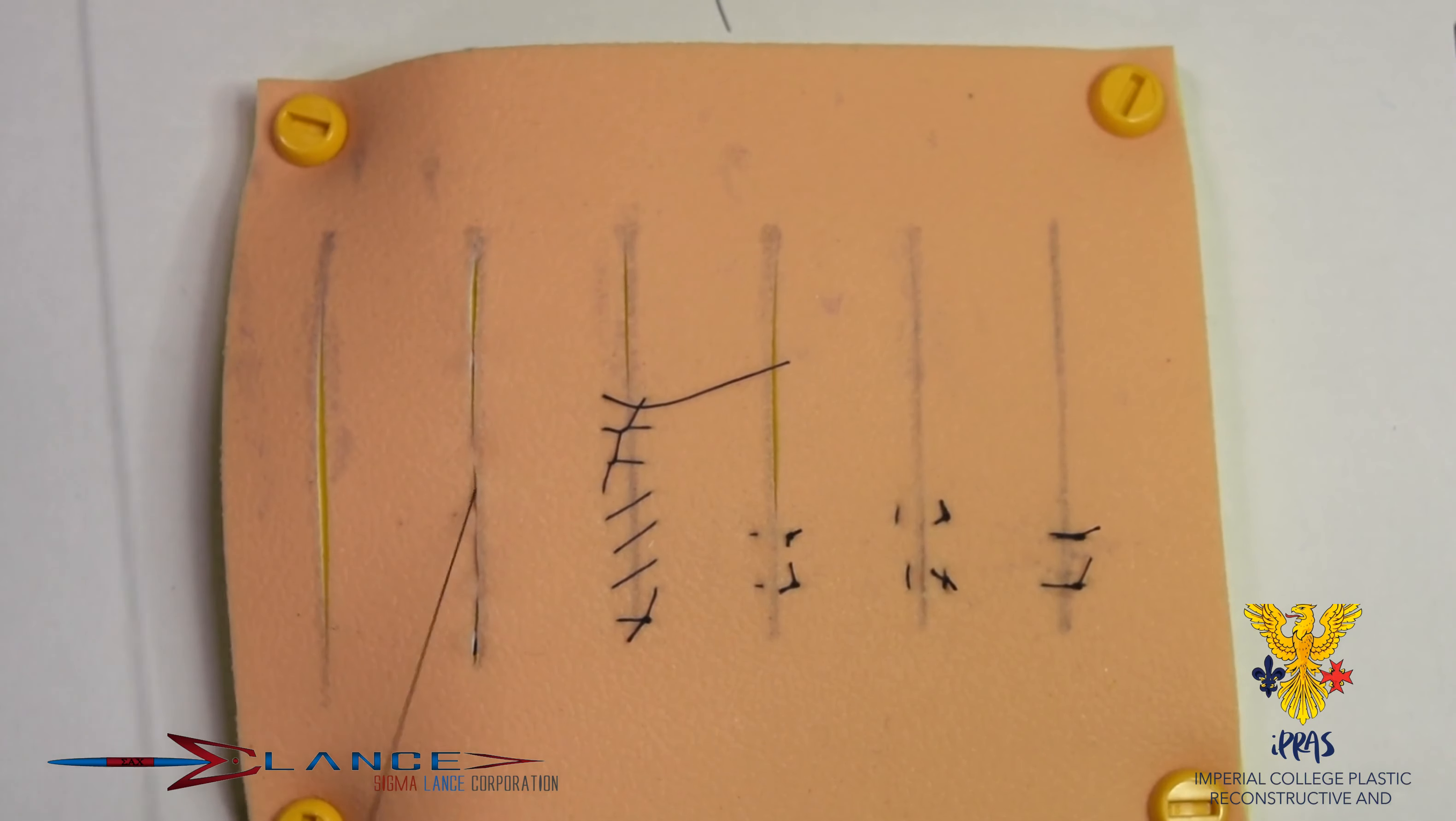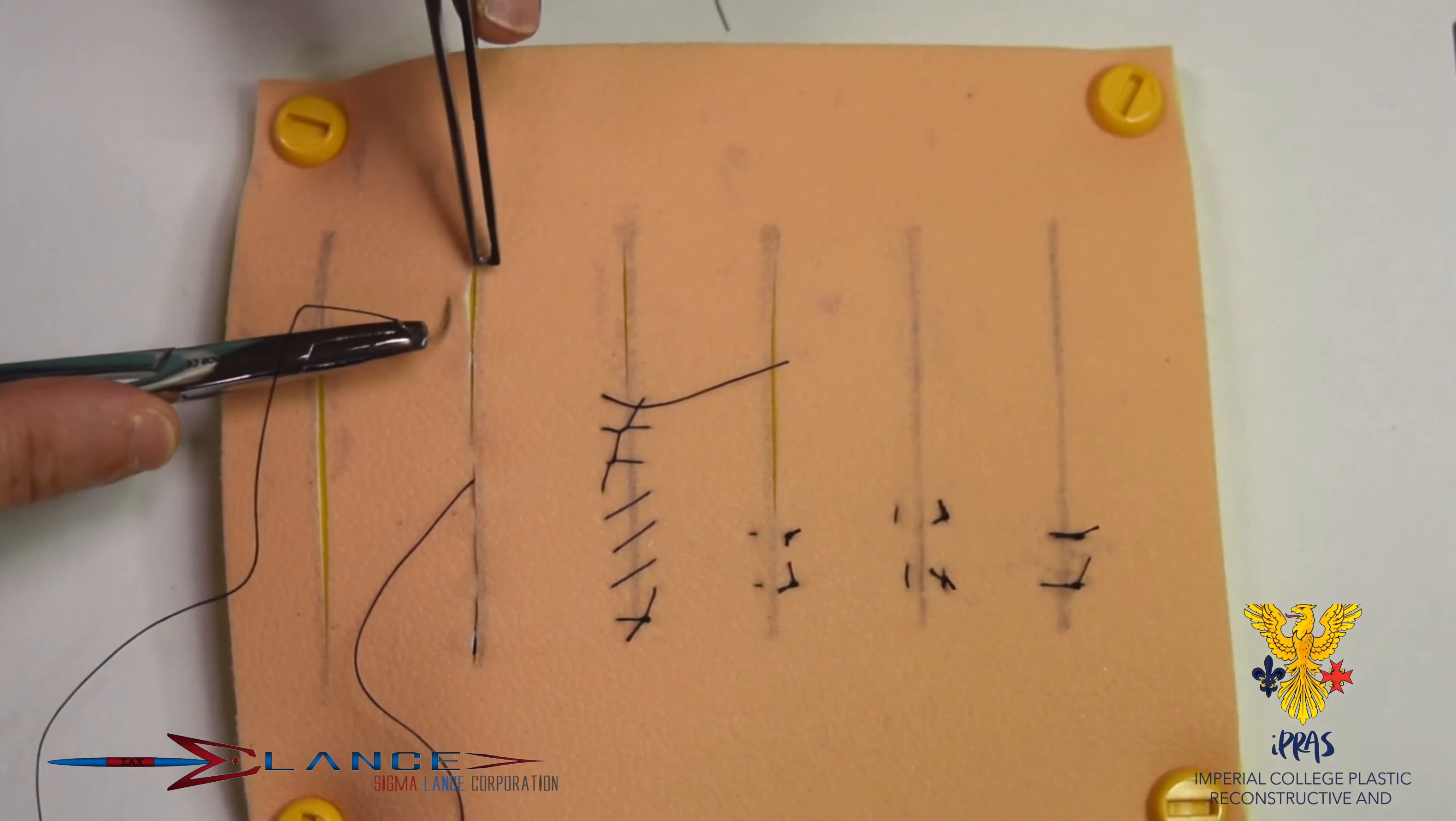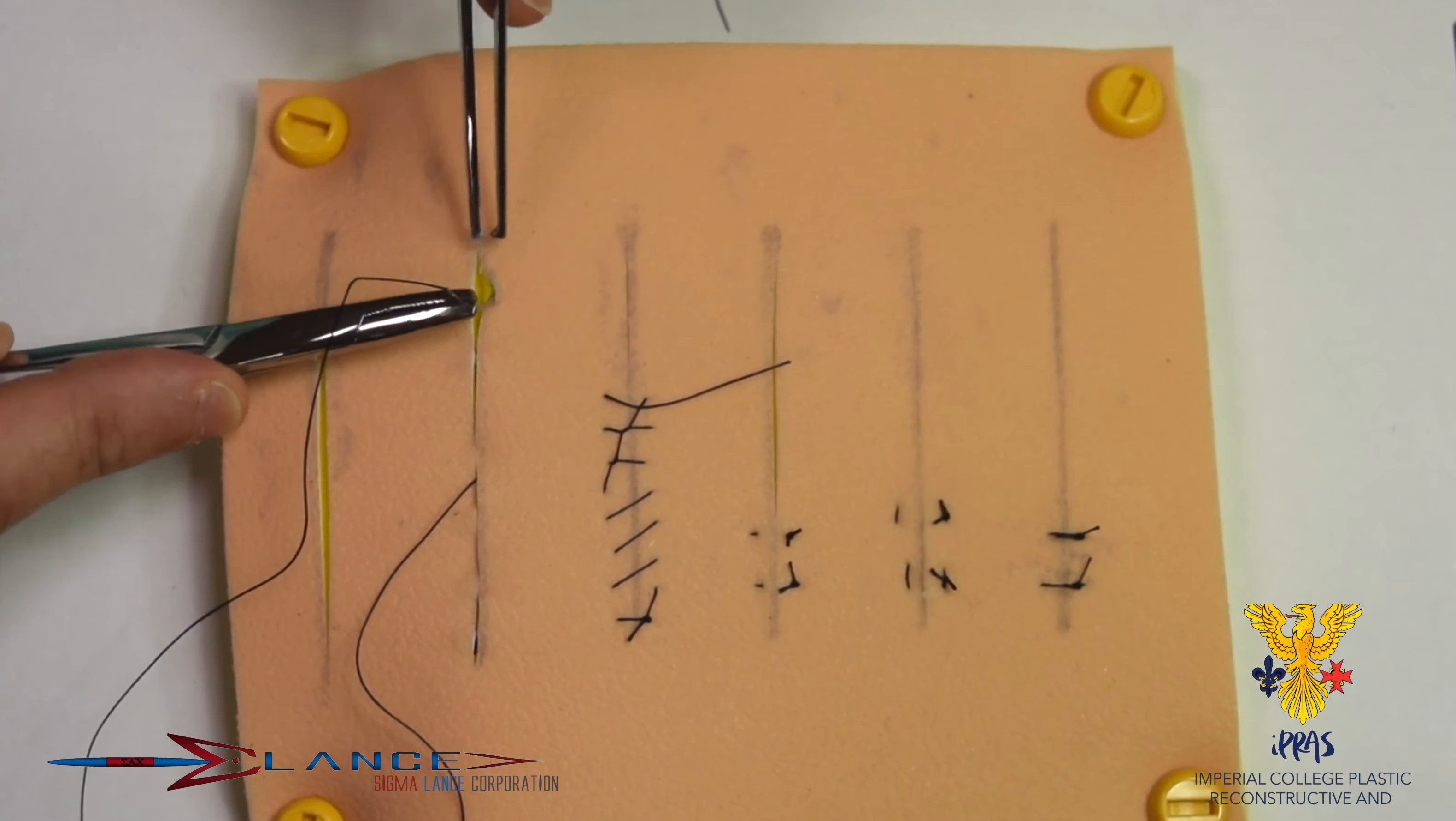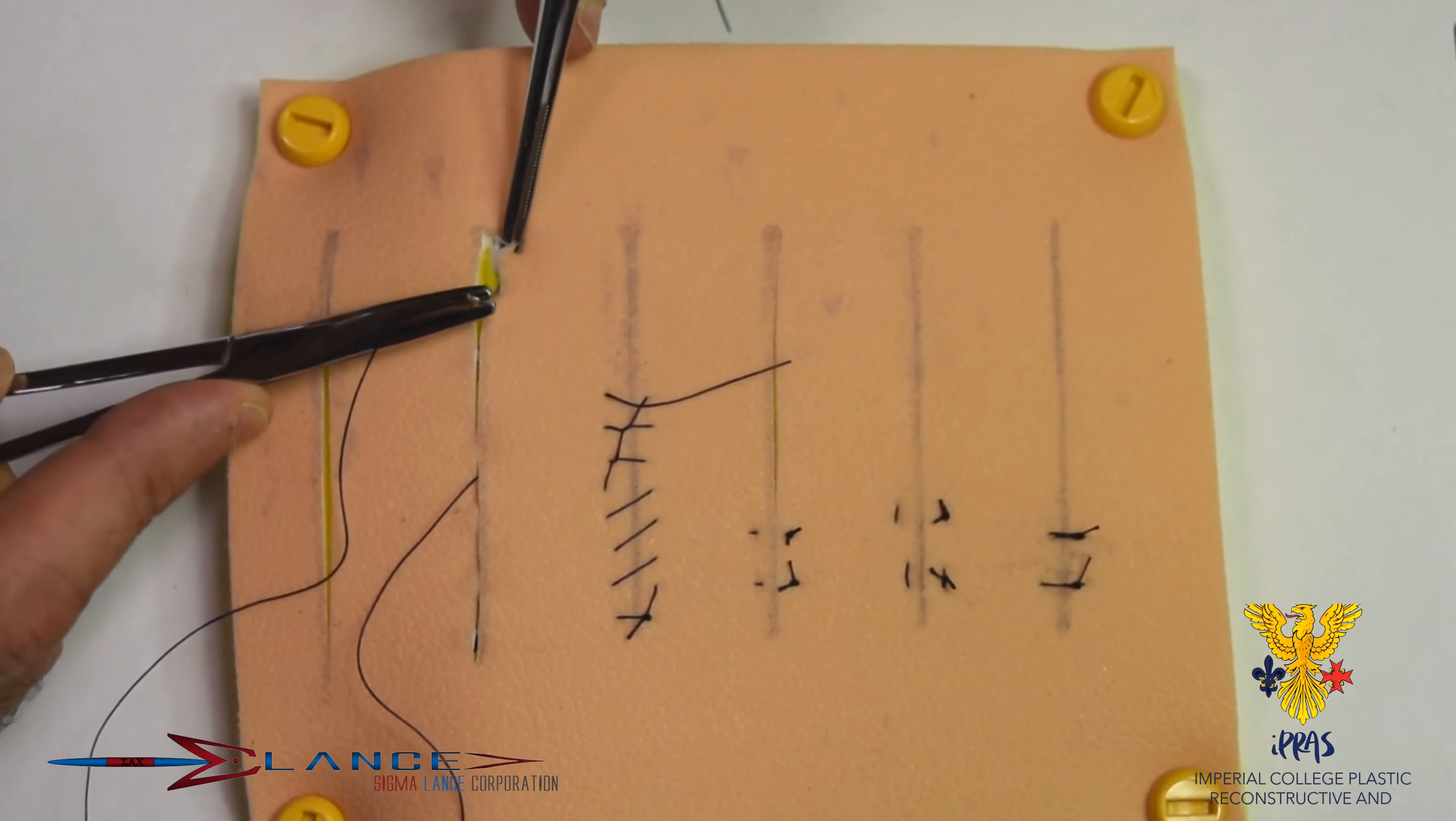Now, for the sake of actually demonstrating the end, once you've gone through, the knot will then have to finish off.